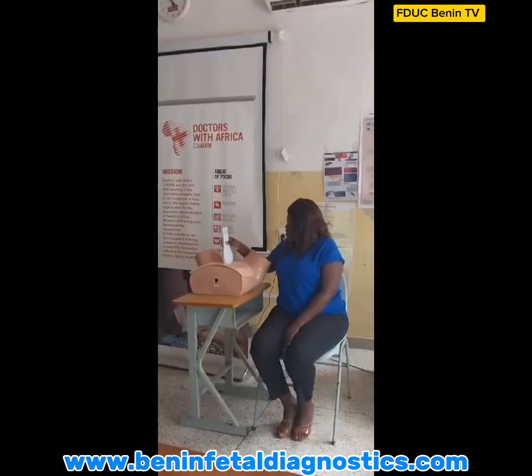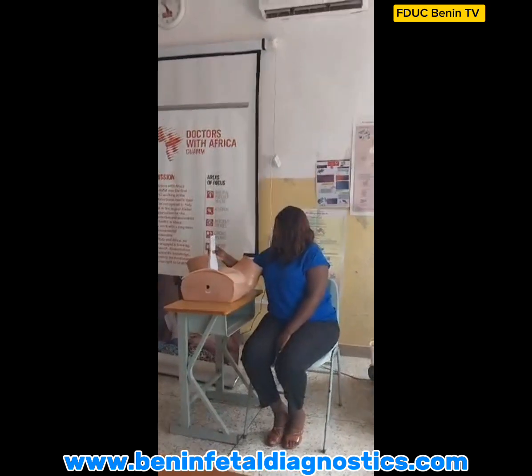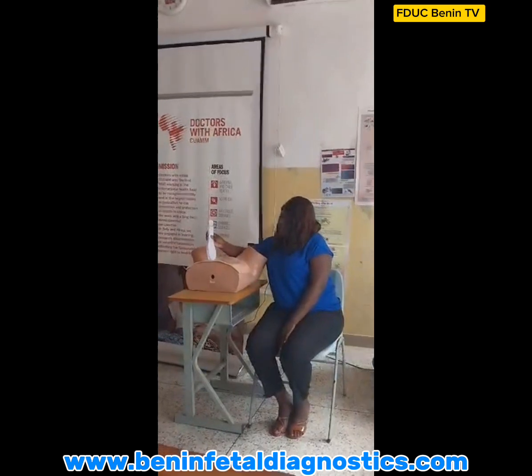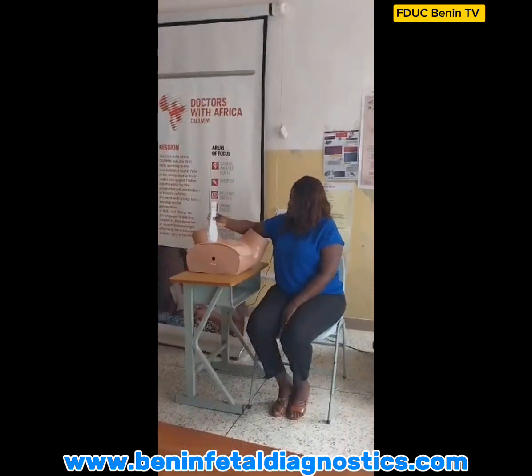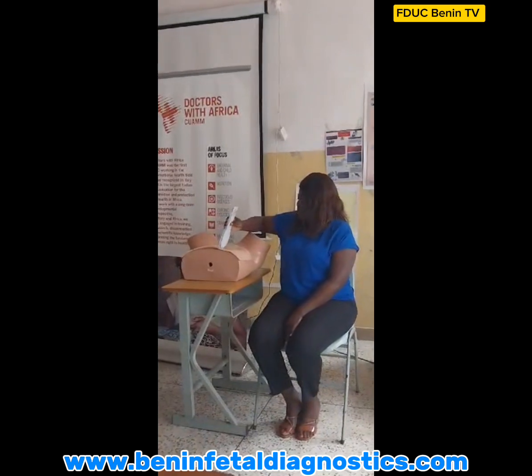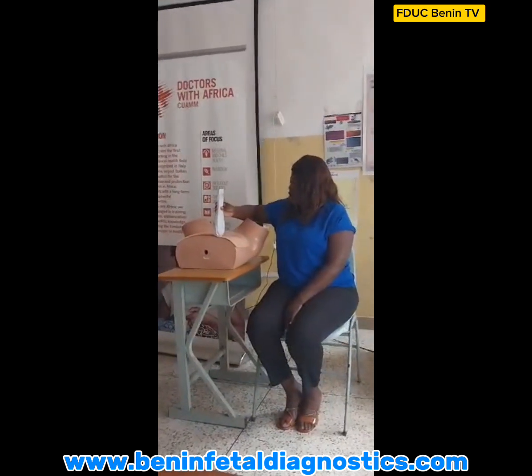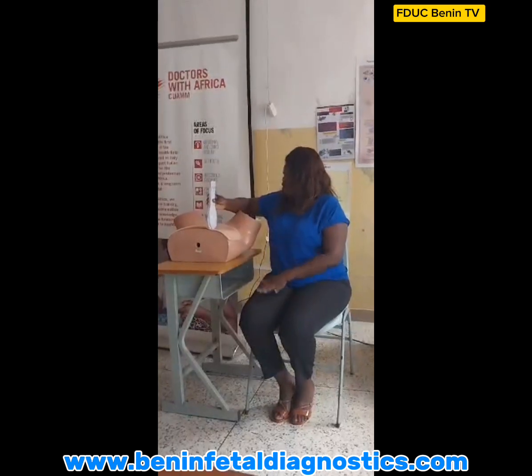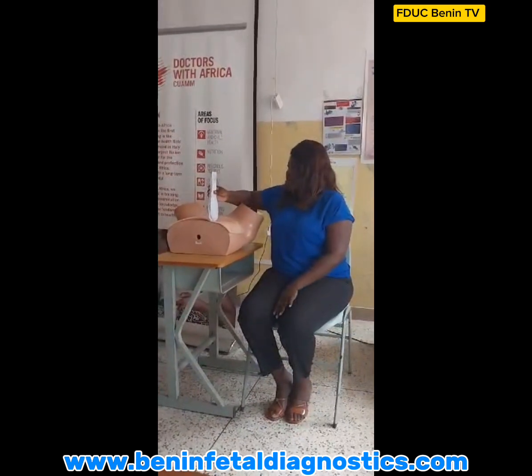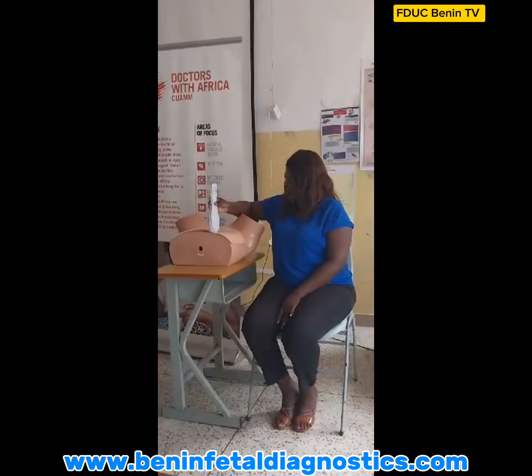So I'll slide on the narrow axis towards the orientation marker on the screen until I get to the fundus. When I get to the fundus, I'll slide on the broad axis towards the maternal right. Then on doing that, I'll also look for structures once I slide, like the fetal heart rate, the abdomen, and also if there's any placenta or liquor.